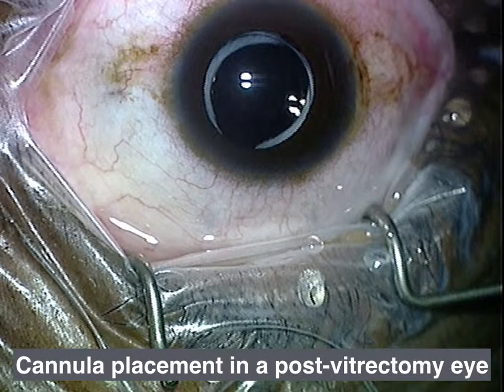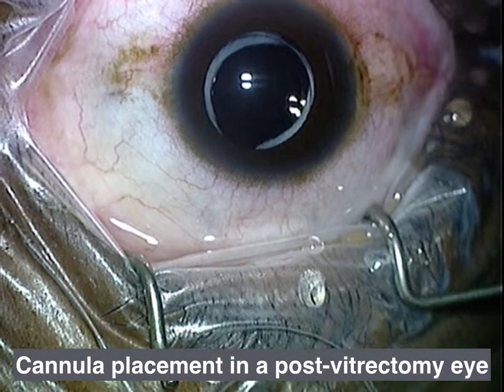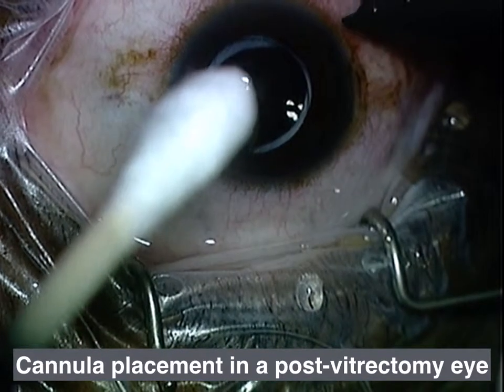Hi, my name is Daryl Baskin, and I would like to show you a video of how I place cannulas in an eye that's had a previous vitrectomy. Eyes that have had previous vitrectomies are filled in the posterior segment with aqueous humor, and with the placement of the second cannula, that aqueous humor can be expressed from the eye pretty easily during the sclerotomy creation. So I'm going to show you my technique for not deflating the eye during the second and third cannula placement.